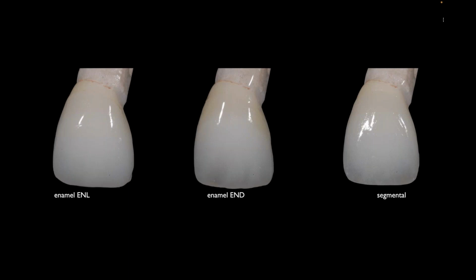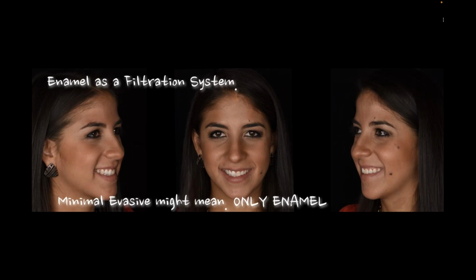On the other tooth, that was a little bit of a whiter, brighter tooth, I did the exact same thing. So on the whiter, brighter tooth, just the enamel, 2/10 to 5/10, you can see I've masked out everything. You really don't see any color underneath. With the END, which is much more translucent, you can see some of the value that was in the middle third, but now look at how much more translucency and mamelon structure you see in that incisal third. And then again, when I go to the segmented one where I've used 4 or 5 different enamels, again, I think that one really looks the best depending on what effect you're looking for, but that's where you really can start to see what the enamels can do and how you use them to emphasize the coloration.